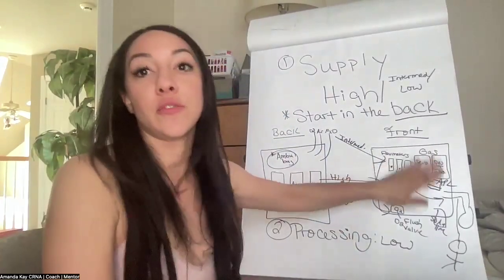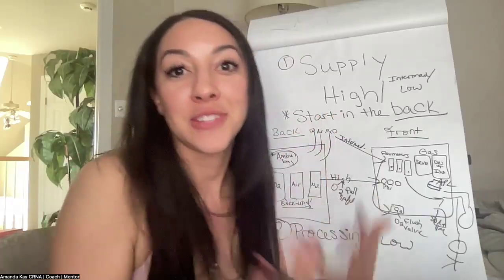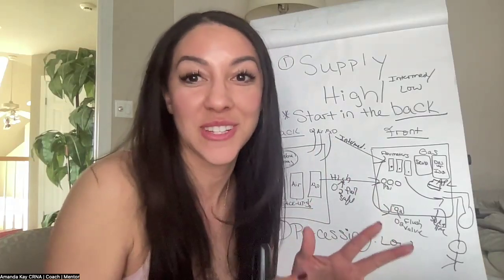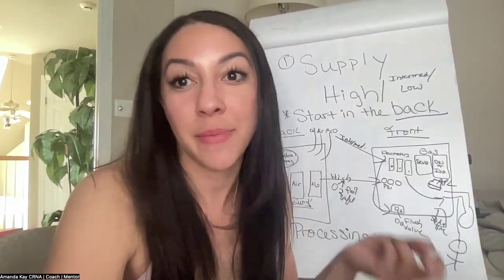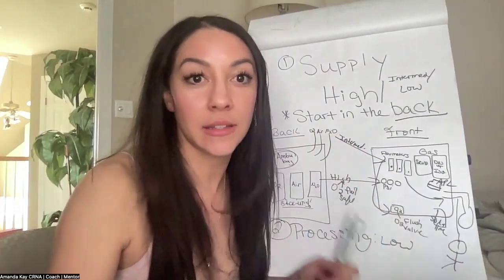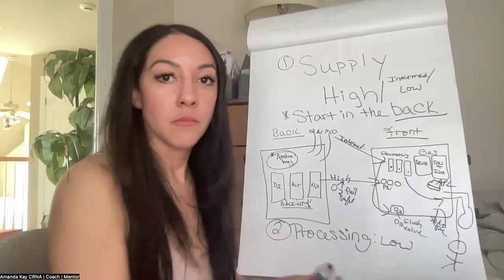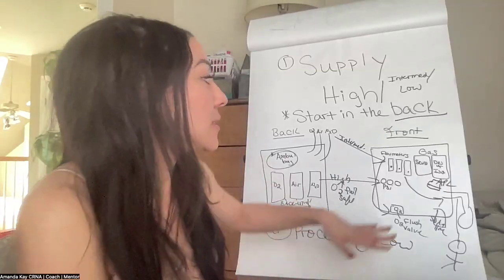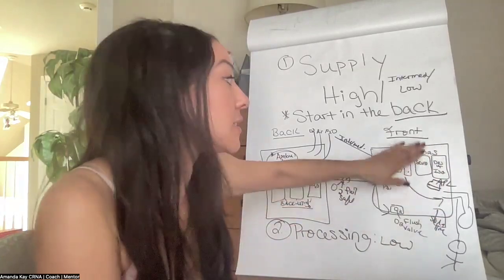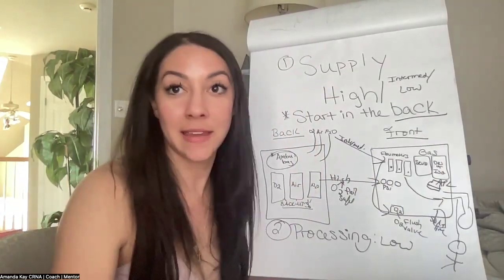And then you have your vaporizers, which we talked about. They take liquid anesthetic and convert it into a vapor. I have a masterclass on that in my coaching program, and we could do a whole video just on that. But they basically work via your GABA A receptor to keep your patient sleepy. So that's processing, and a lot of the processing is the low pressure system. Those are all the pieces of that. The big clinical pieces before you get started are leak checks, checking for any leaks, and making sure your gases are filled and ready for the day. Fill those bad boys up.